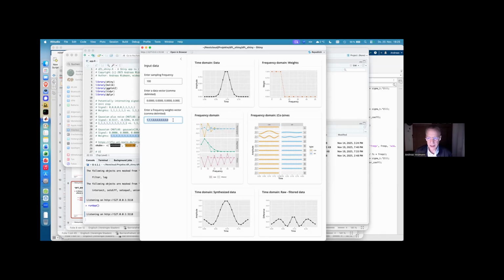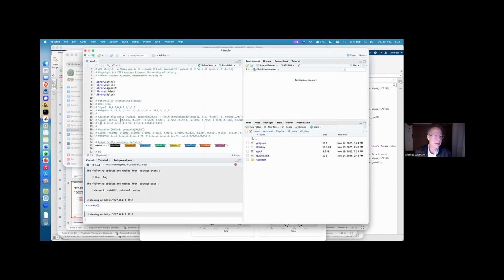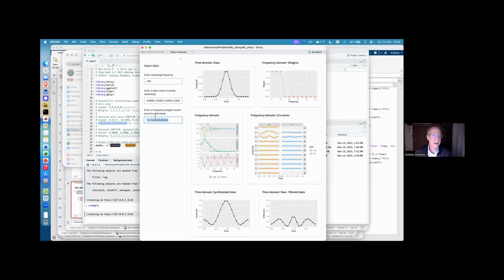And we can, of course, also approach that from the other side. From the low frequency side, the lowest frequency component is always DC, so just the mean value of the signal. We can typically safely remove that. It's just demeaning the signal. So the mean is now zero here. We have just shifted the signal.